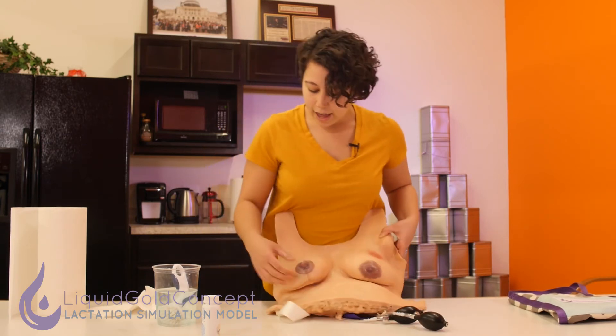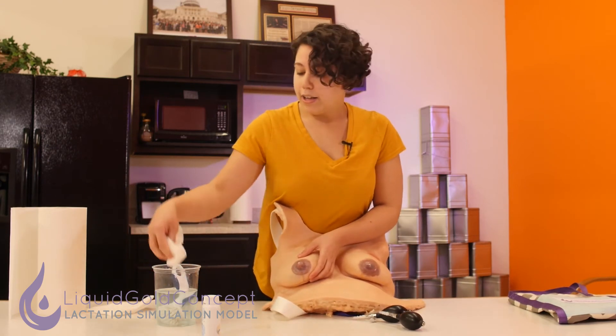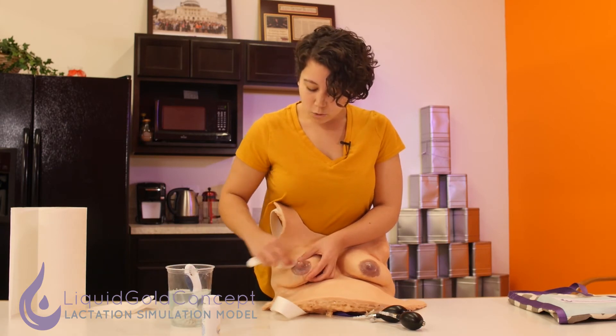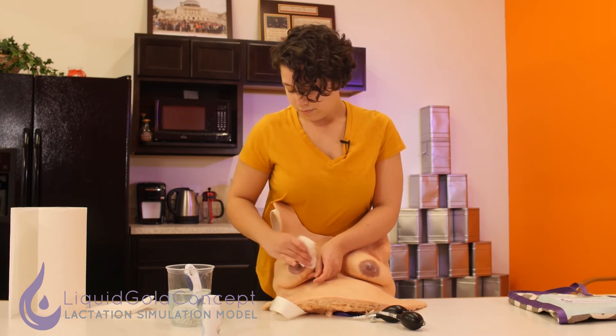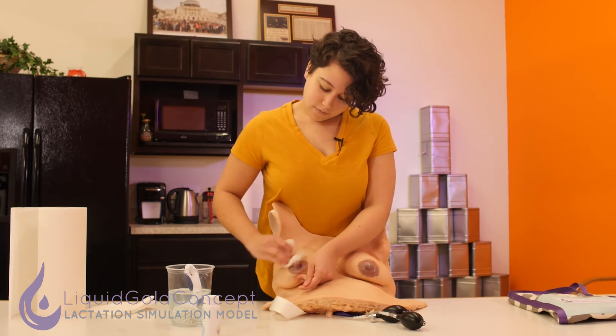Once you're done, you might notice that the coloring on the areola and nipple now looks kind of pale. A nice way to fix that is to just dip a paper towel into that warm soapy water from before and then just wipe a little bit away from the surface and dry it off. And now you can see that it matches the other side a little bit better.